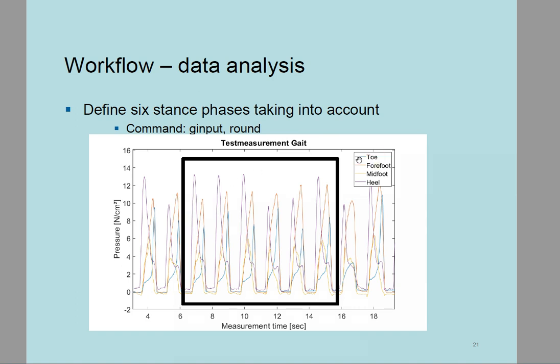So you can see this one is the toe, the forefoot, the midfoot, and the heel. We can look up if it's true. So the heel is this color. Okay, the heel is the first one, that's true. Then the midfoot is in action here, down here. Then you have the forefoot, and the last one is the toe section. So looks good in this case.